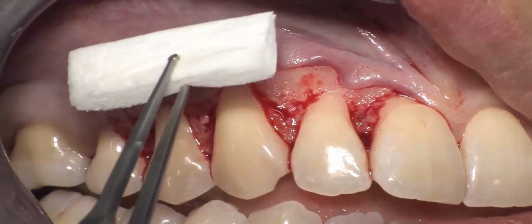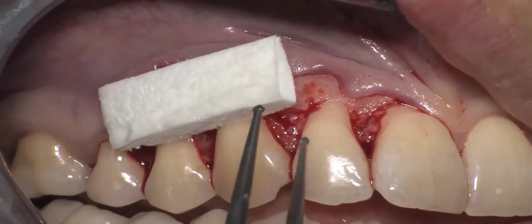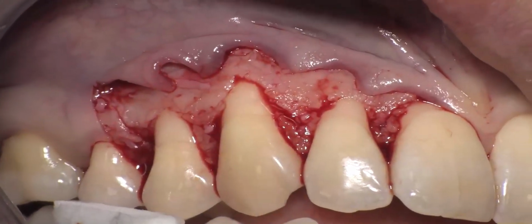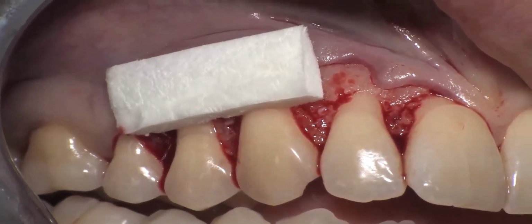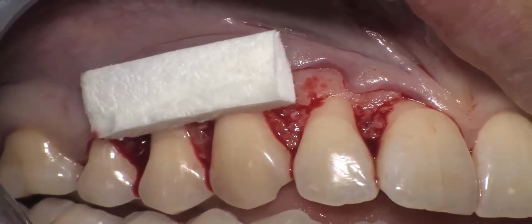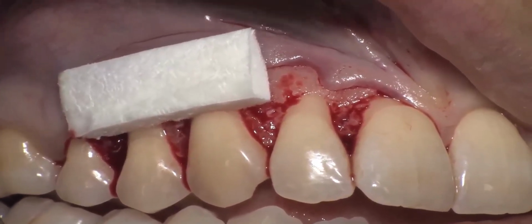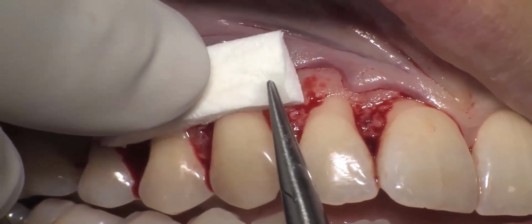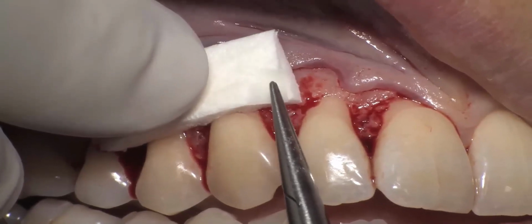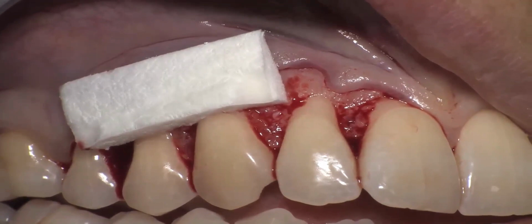Okay. The material seems to be very, very thick, but you will see that much of this material will be reduced in thickness after suturing it. Now, the most important thing is to stabilize this papilla, and so that's why I wet it at the base of the anatomic papilla.